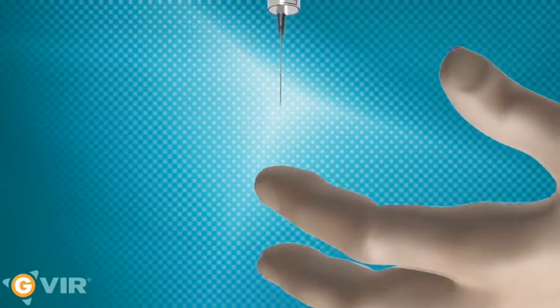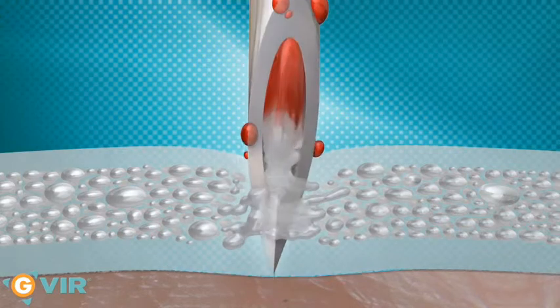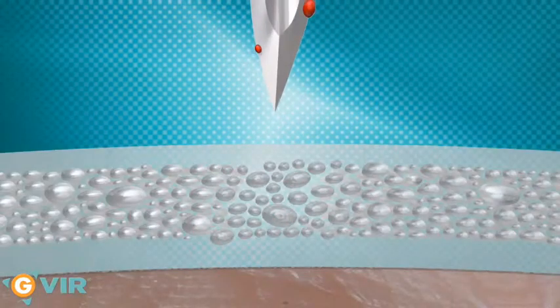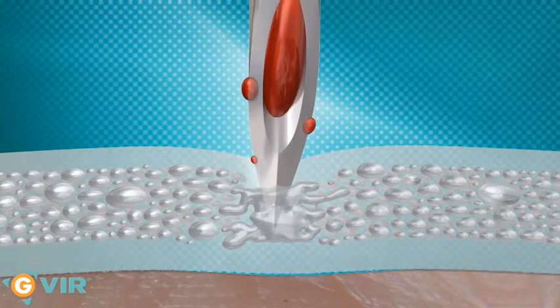In the event of a percutaneous accident, seen here with a hollow needle, the disinfecting liquid inside the glove comes directly in contact with the inside and the outside of the perforating object. The needle first distorts the outer layer. This pressure breaks the thin elastomeric wall separating the droplets and allows a large volume of disinfectant to collect at the point of damage.